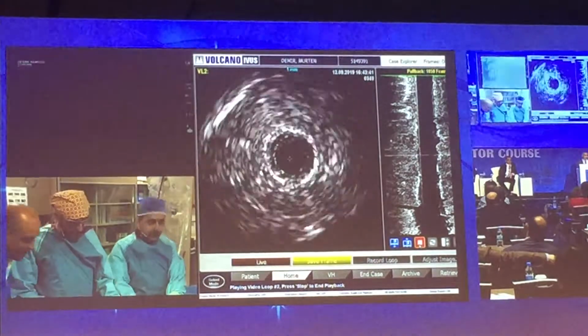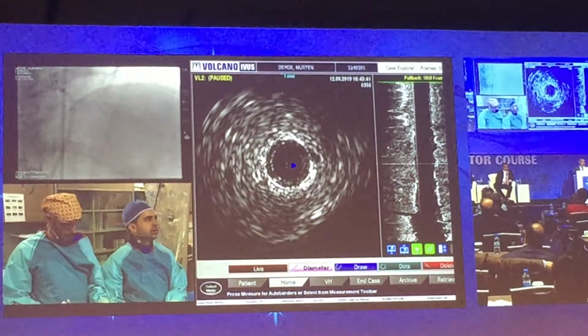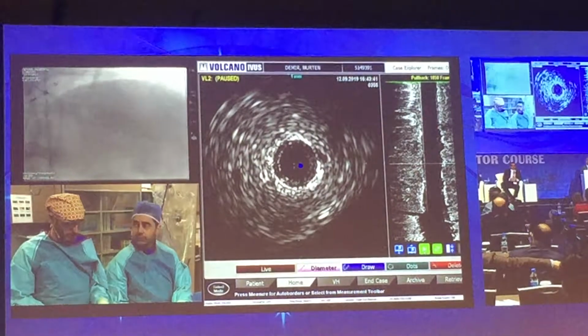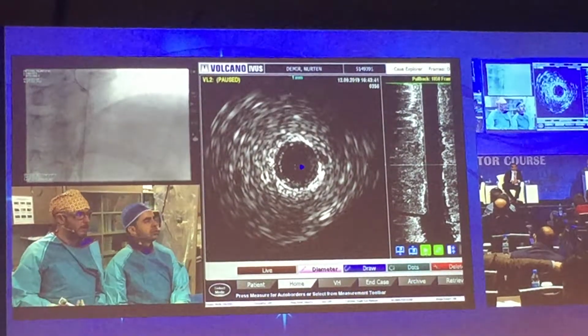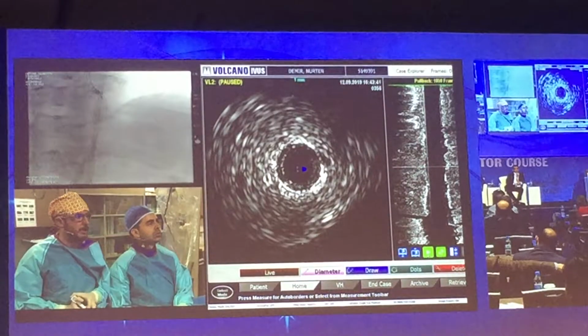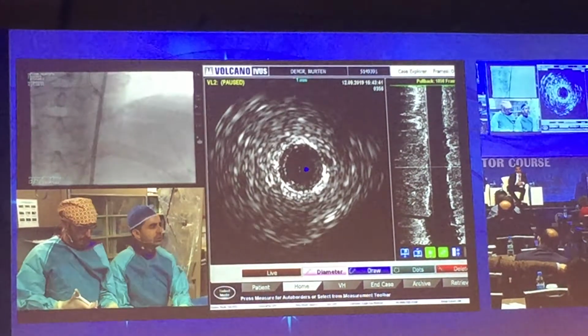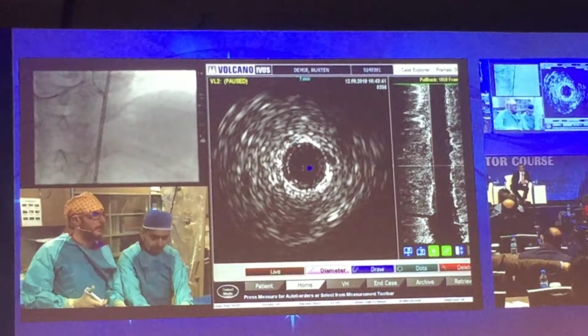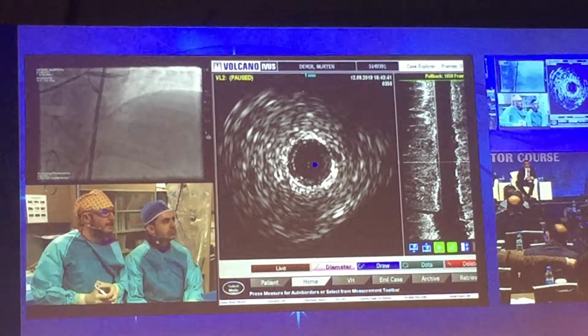Cranial, not? So what is your suggestion? Left cranial please. Left cranial. Let's see the last shot. Left. Okay. Contrast. Film.